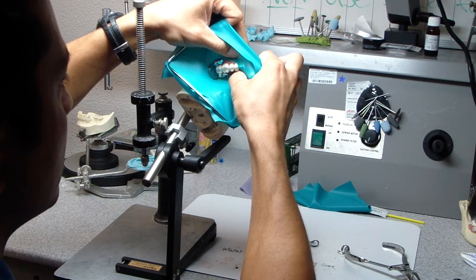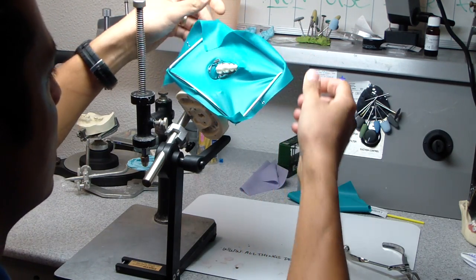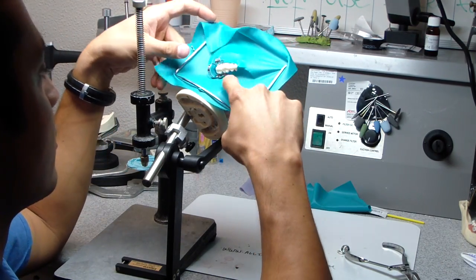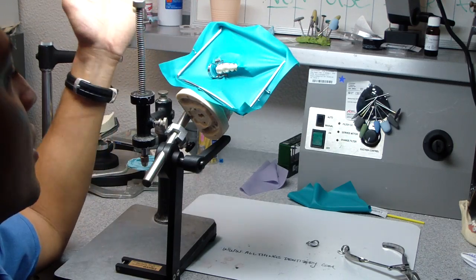And usually if I snag it in there, I don't need to floss, sometimes I do. And there you go, and then I try to move this under, it kind of gets, there is some fluid leaking in there, but I'm telling you it's way faster.